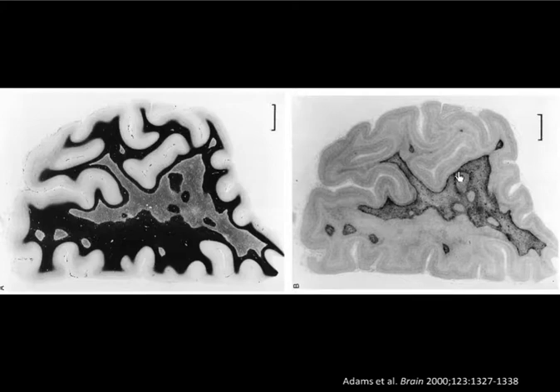And these findings on MRI are consistent with neuropathological studies showing that in a significant proportion of cardiac arrest victims, the most severe damage is, interestingly, not in the gray matter, it is indeed in the white matter, and in the white matter that connects the different parts of the brain to each other.